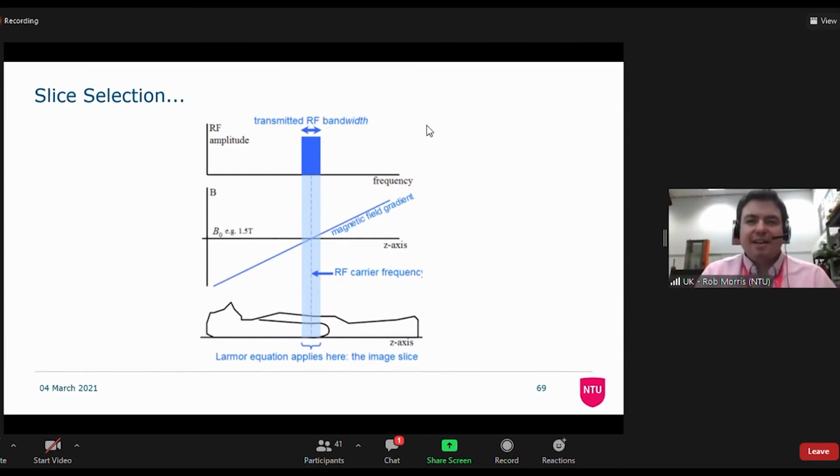And actually it ends up impossible. So on a lot of clinical scanners like ours, you'll just have a movable bed. We can do slices over 500 millimeters. If we want to go to 600 millimeters, you have to move your subject along, because you can't actually manage to get the bandwidth, frequency shift or gradient which you need to move off the edge of that.